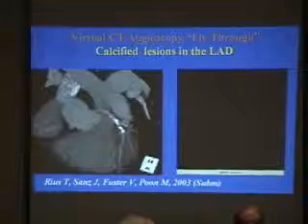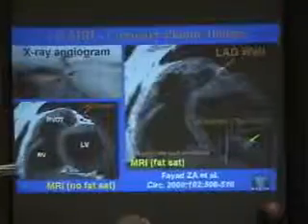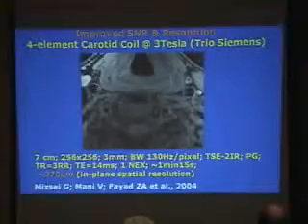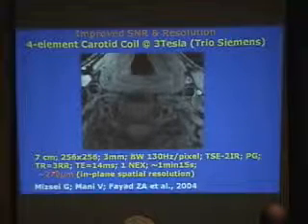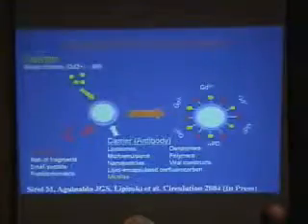However, technology is advancing very rapidly. I see Dr. Rius here, Teresa, who has done fantastic work on the so-called angioscopy, and we saw something in the coronary arteries that appeared to be like a plaque with a high content of fat. Today, the resolution is much better. It is 270 microns here, so that you can distinguish slice by slice.